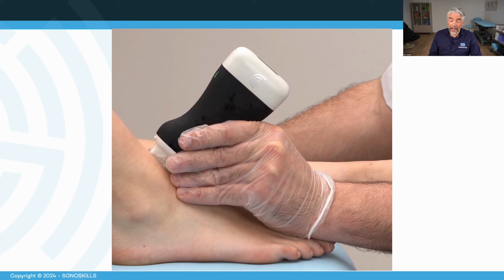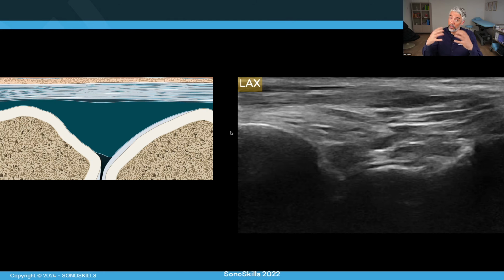To look at the talar crural joint, we can make a plantar flexion of the talar crural joint. The joint opens and we can see beautifully part of the talus covered with cartilage. We can see the tibia and also the capsule, the talar crural joint capsule in the middle. On top of it, we can see the tibialis anterior tendon.